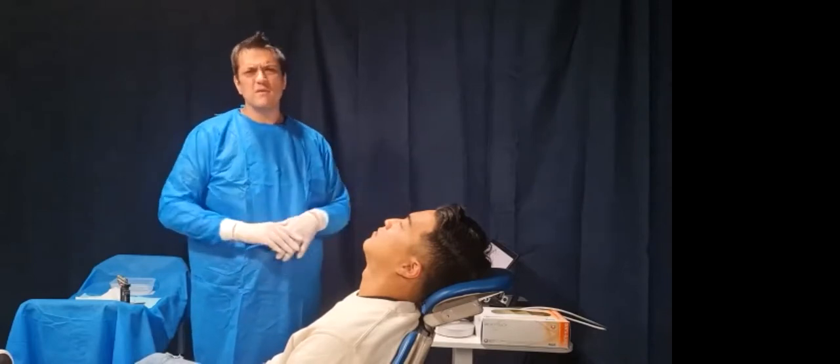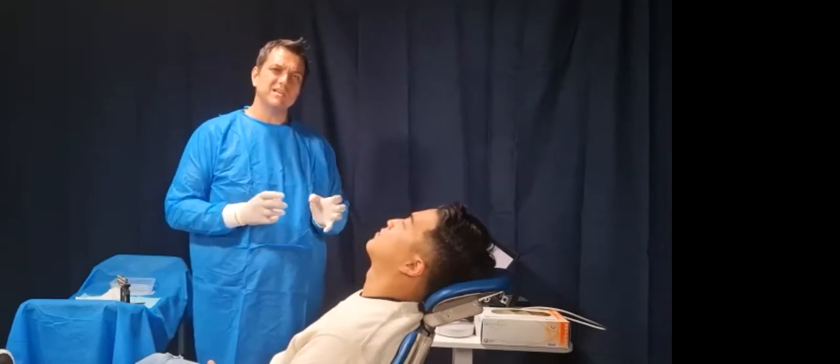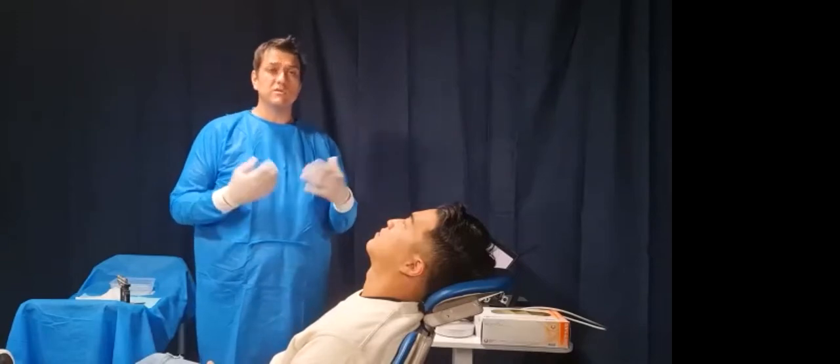You may have another way of doing that, cotton wool to open things up. That's fine, but this is something that I found to be quite good, and we also added a verification step. When we did this technique without scanning, there was always a risk that when we sent the bite, which was wax inevitably, there would be some damage or distortion to that. But with the digital, you actually don't get any of that, so it's quite good. So that's the first thing we're going to do with our patient here today.